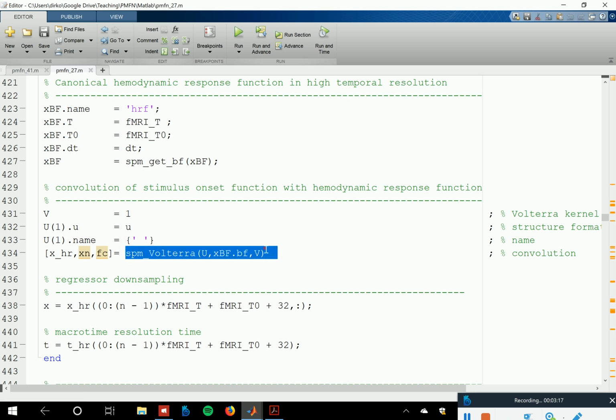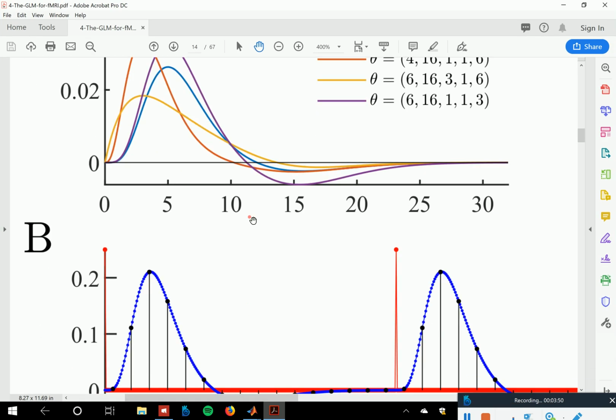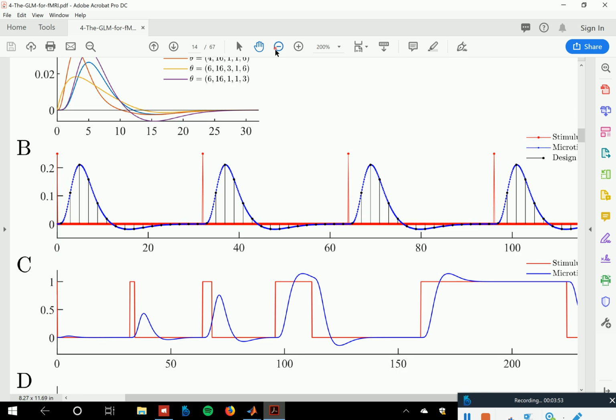So what I'm trying to say is, if you do your own GLM analysis and you really want to understand how SPM creates your design matrix, or FSL creates your design matrix, have a look at this code and simulate the stuff. So we use that in Lilla's project. We actually use that a lot, because the SPM output only shows you your design matrix, and then you can try to look at it and from the gray values infer what you have modeled, but one can do more. So I used this code to do some simulations here.